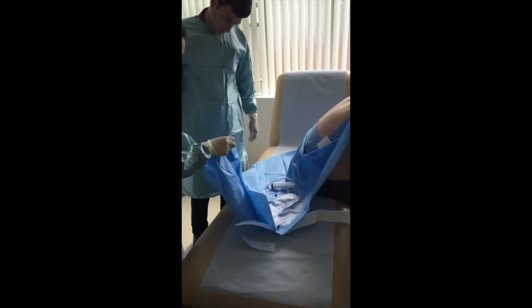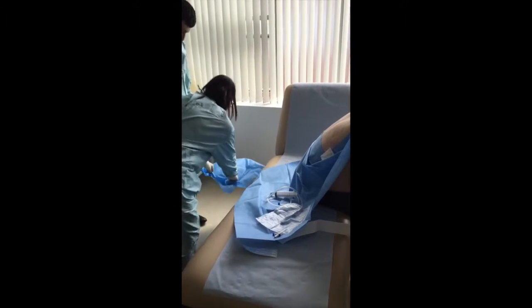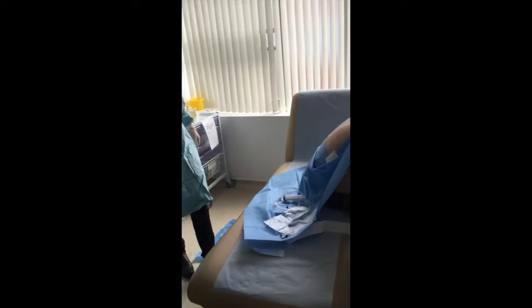And then we can use this sterile towel on the bottom here to pop on the floor. So if we put the bag down there on a sterile field, then gravity will do all of the work for you. So don't stand on that, just to keep that nice and clean.